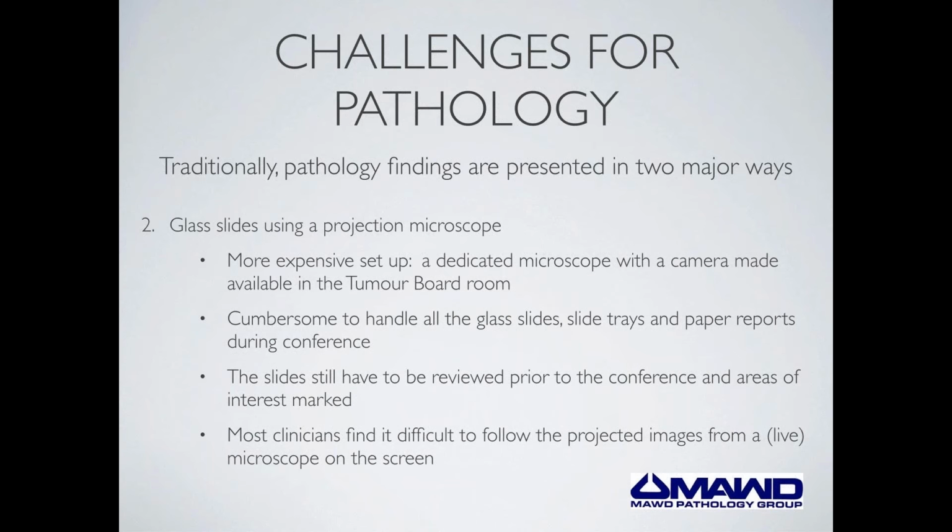Now, the second most common way for pathologists to present at tumor board is to take a stack of glass slides and use a camera attached to a microscope in the conference room and hooked up to a projector to display images. Now, these quote-unquote live images still need to be reviewed and marked prior to the conference, and this setup is quite expensive and quite honestly cumbersome.